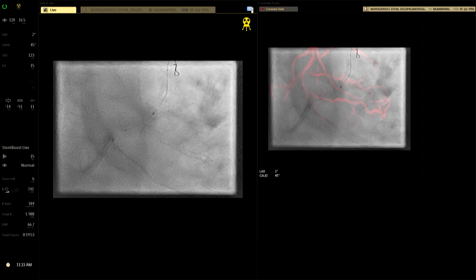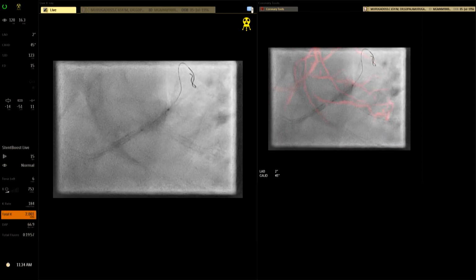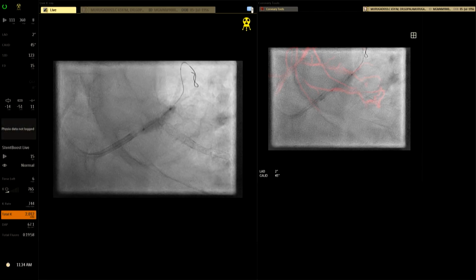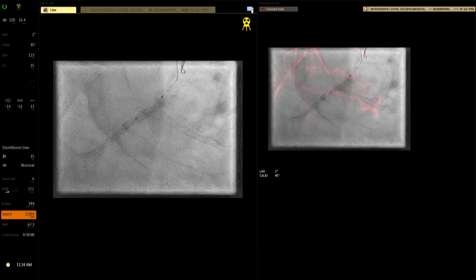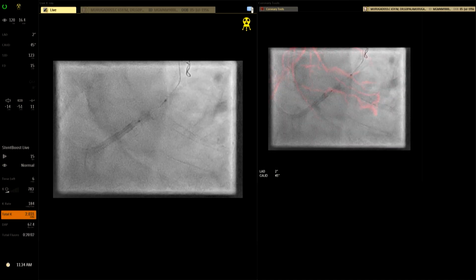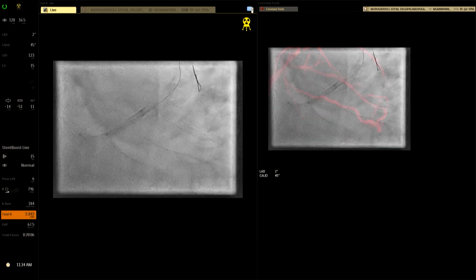Okay, go up there. 18, 20. 18, 16, 18, 20. Take another wire. Whisper MS, please. Down. Lay down, sir. Okay.